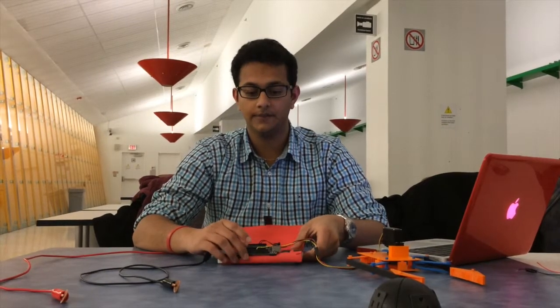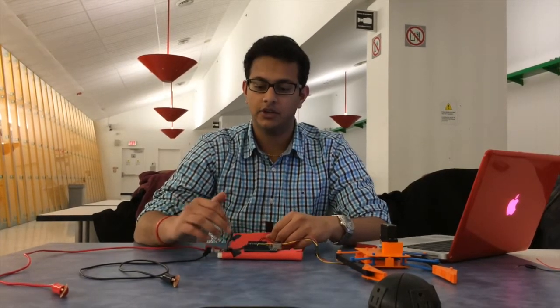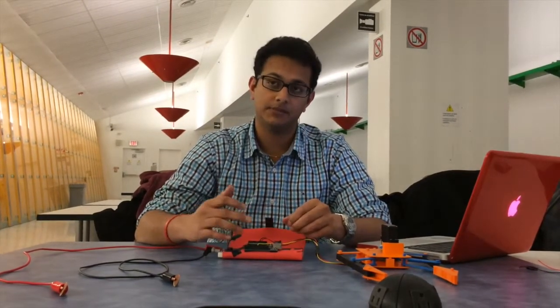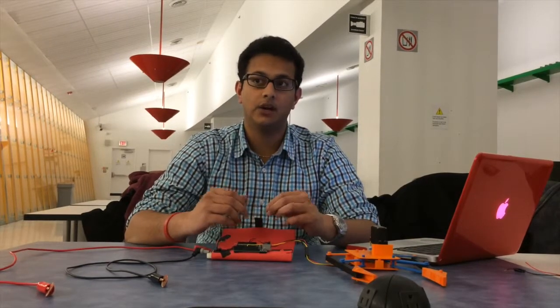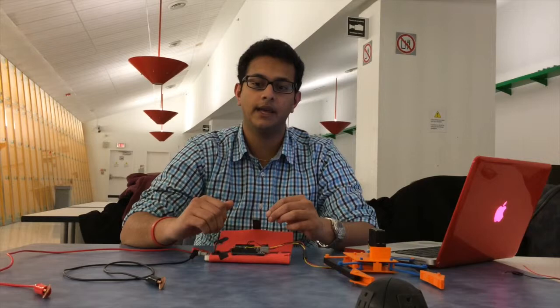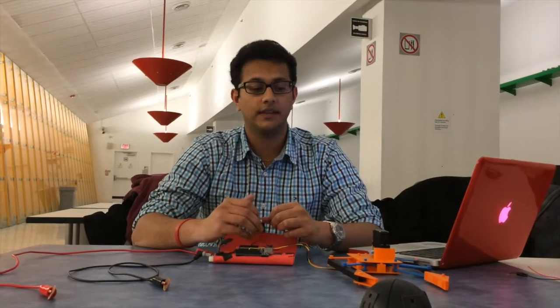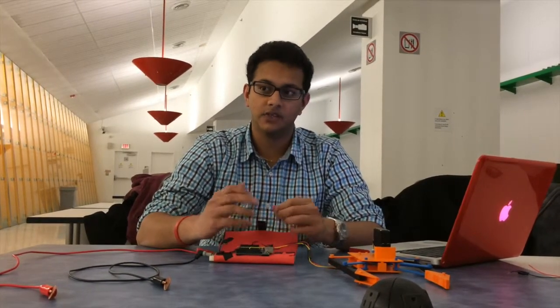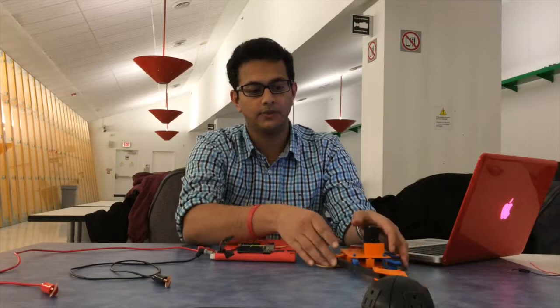So right now I'm going to talk to you about the Arduino and the signal processing. So right here, this is the Arduino board that we use to control our prosthetic arm. What happens is an AC signal is sent to the Arduino through the circuit, and that AC signal is converted into a digital signal which goes through the multiplexer, and the code tells the Arduino to move the servo when a signal of more than 3 volts is hit. So if a signal of more than 3 volts is hit, then the Arduino will tell the servo to move, which moves the hand. And when there is no signal being sent, the servo will go back to its original position, which is back to 0.